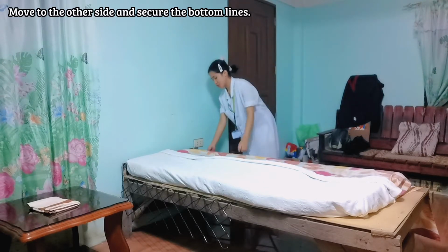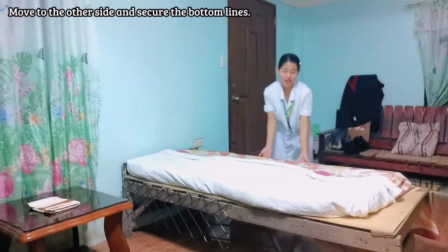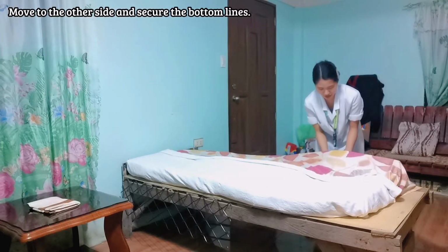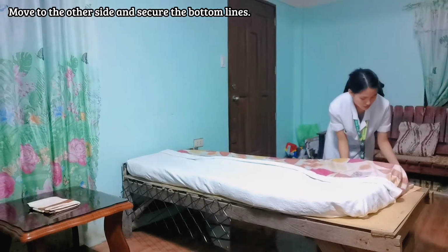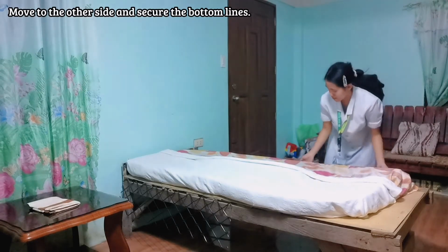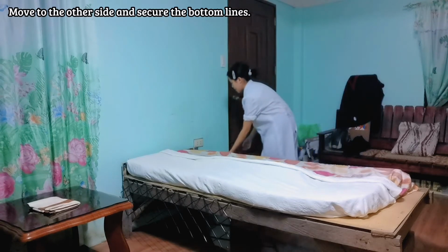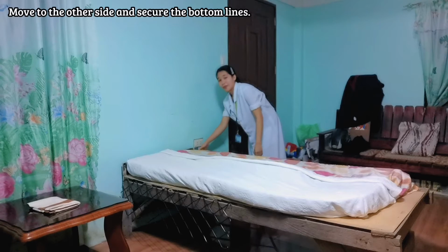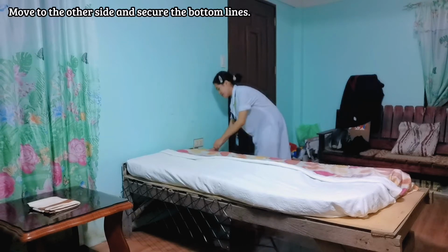So we're going to tuck the bottom sheet under the mattress. And then we are going to miter the top edge of the bottom sheet.